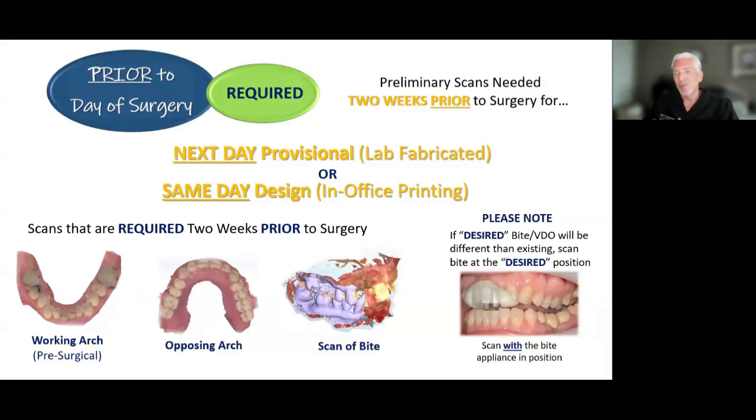This is something where people get into trouble. They don't do what you're seeing here in the bottom right, and they're overcompensating, and then they're fighting it. They're doing a lot of occlusal adjustments, there's a lot of patient discomfort, and you're putting these implants at high risk of early failure.